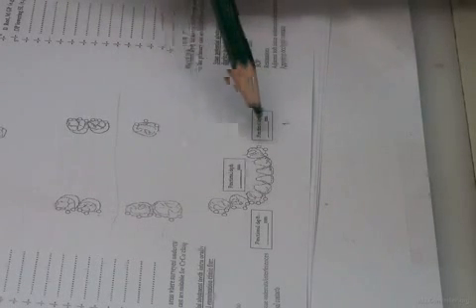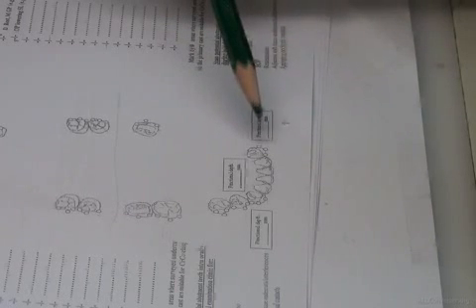So the idea is that here we need to release the stress on the abutments, and usually the abutments we release the stress on are premolars and anterior teeth. So to release the stress, I'm going to the RPI system. Okay? It's now not for aesthetics, it's now for support reason. This is a different case.